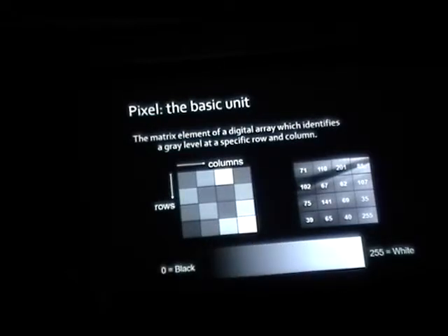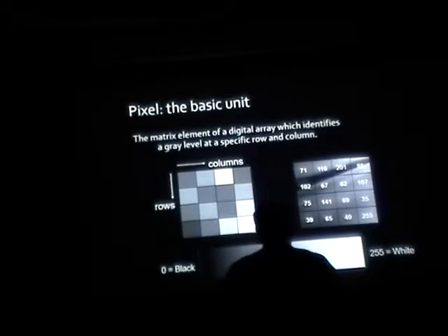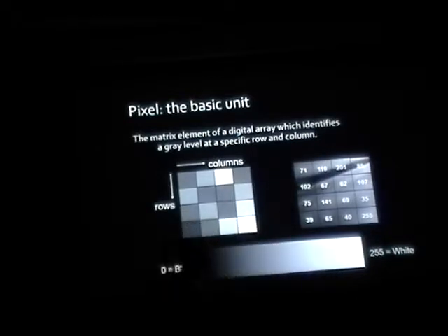So the thing is, even if you have more pixels with the digital sensor, if your computer is not going to display more than 256, and the sales representative comes and tells you, we have 450 grayscales, this is beautiful, it looks better on your computer, you should understand, because your computer is able to display only 256 grayscales, it's useless. Don't spend your money on luxury things, because your computer is not going to display it. If you upgrade to a computer which shows more colors, yes, then you can buy. Make sense? That's it. Thank you.